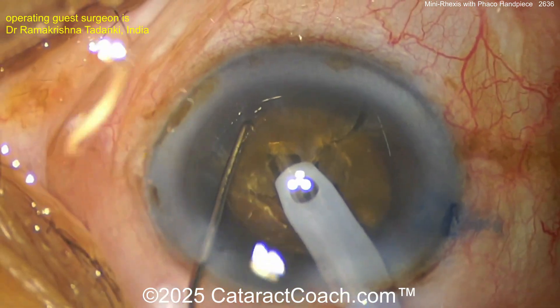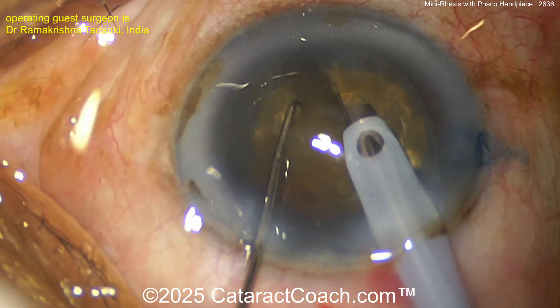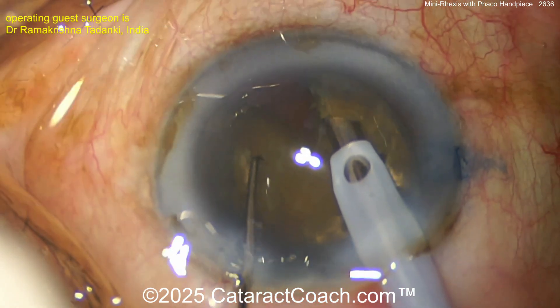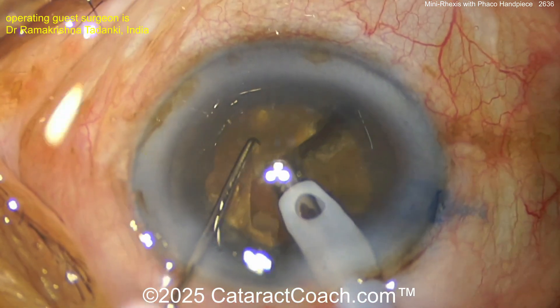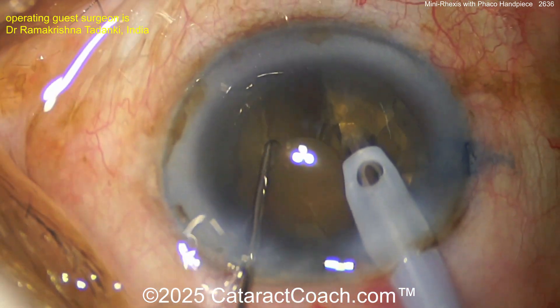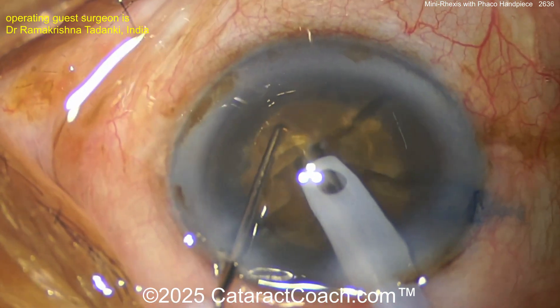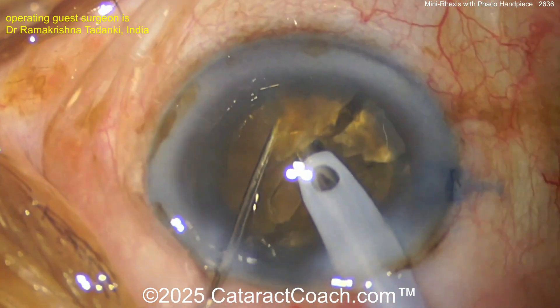Multiple chops like this is probably your best bet. See how the pieces are still attached centrally — kind of like the petals of a rose. More and more chops is a great idea, then take your time separating them out. You've got a nice strong rexus, so you don't have to worry about that.